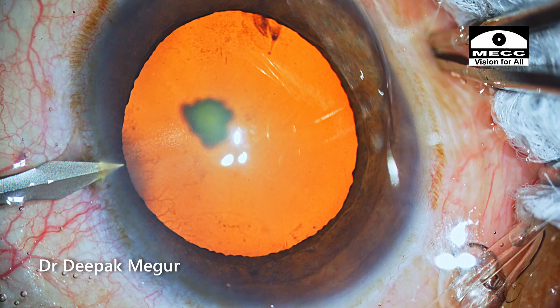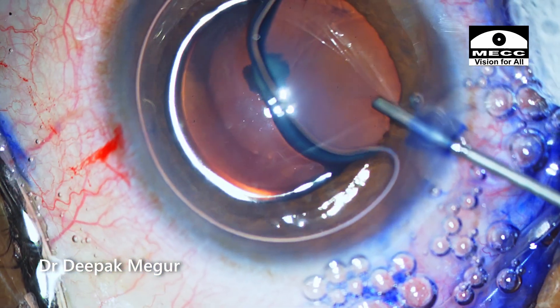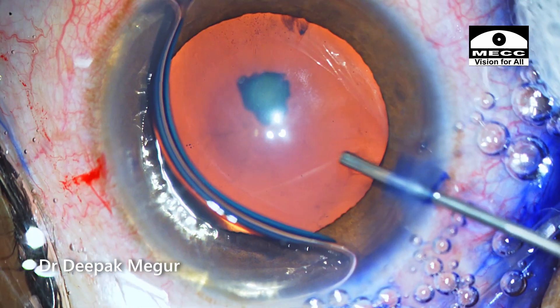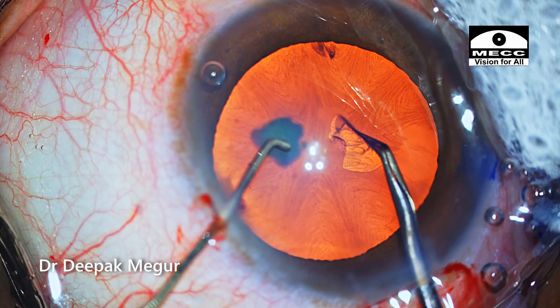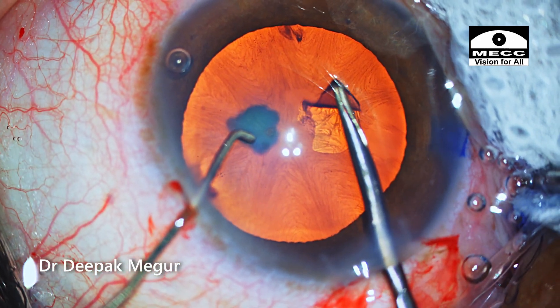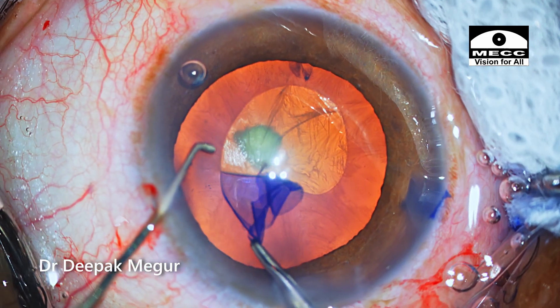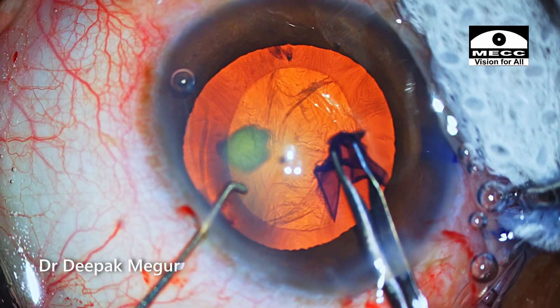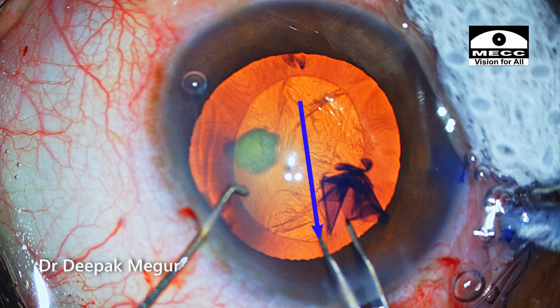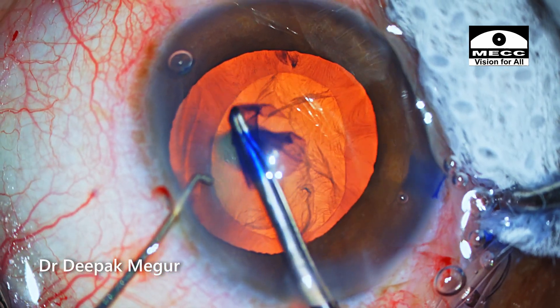Back to this case. I'll be using low flow, low pressure surgery. I'm conscious not to over-inflate the chamber at any stage. In this case I'm aiming for an oval rhexis — a technique propagated by my friend Dr. Kiranjit Singh for such polar cataracts. I'm aiming so that the longer diameter of the rhexis is parallel to the axis of my main incision. The rhexis is oval, though I would have preferred a slightly bigger one.